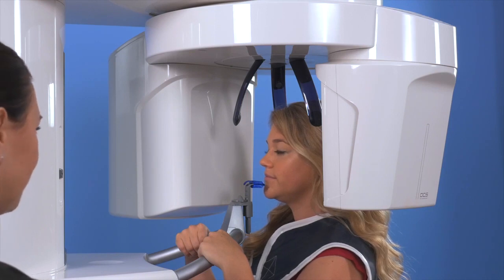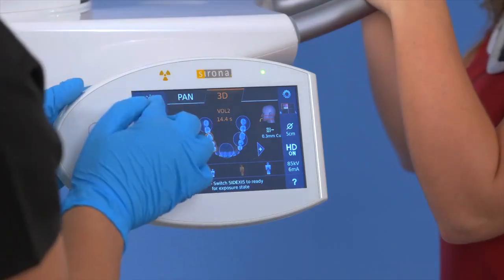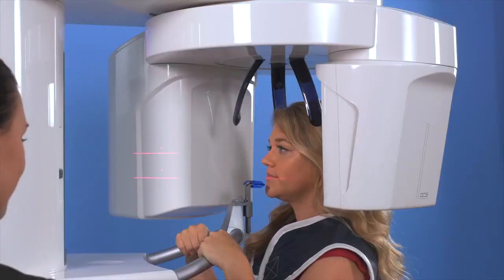Because we are going after tooth number three, we will turn on our light lines to show the upper and lower borders of the smaller volume.